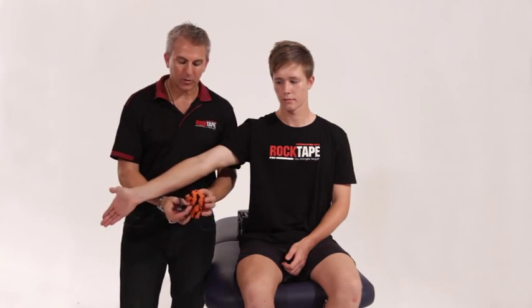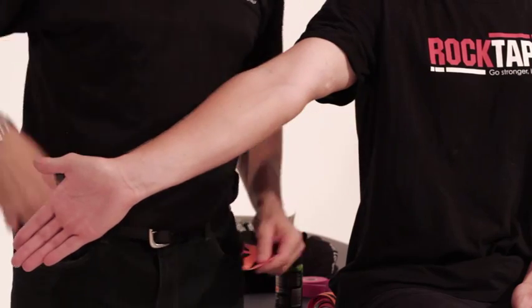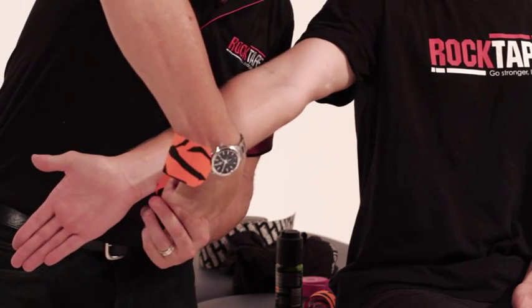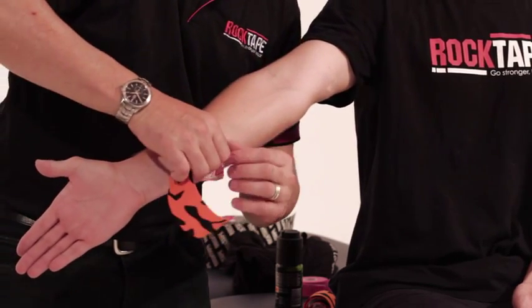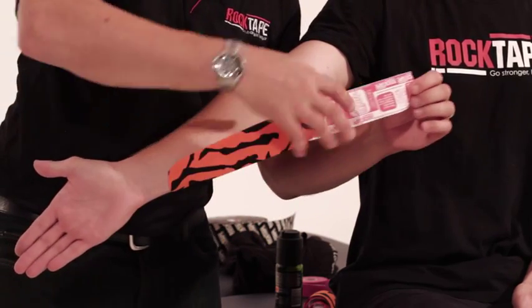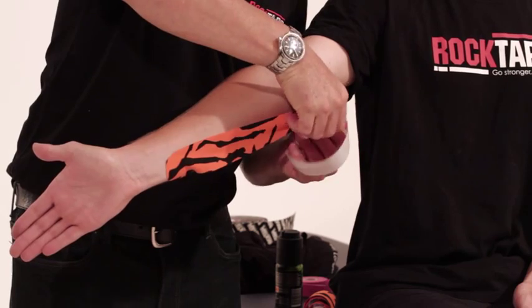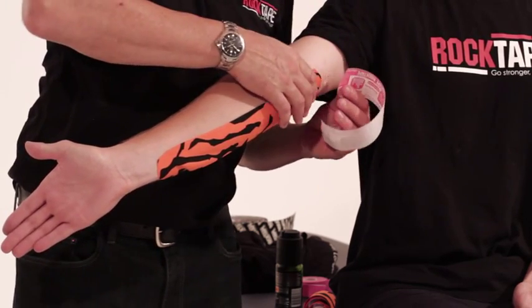You then round the corners, and with the application the first three centimeters has no stretch on it. You then put about 30% stretch through the middle part of the tape over that tender part of the bone — the medial epicondyle — and then lay the last three centimeters down without any stretch.